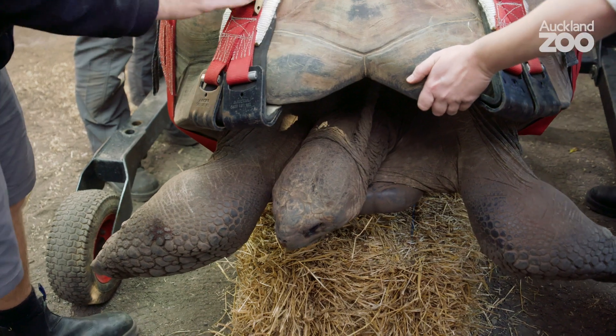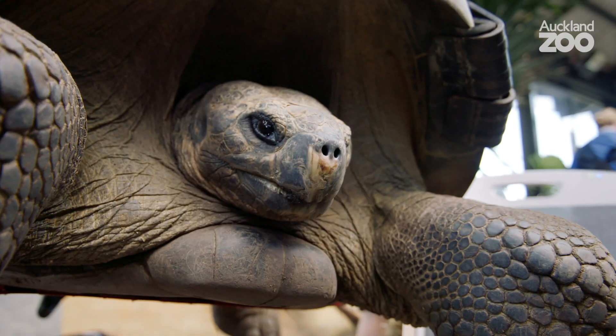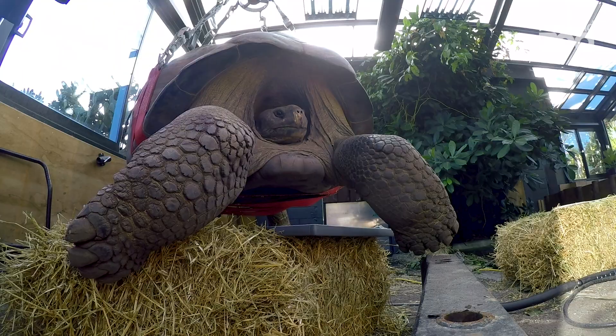One of the challenges with looking after these tortoises is that they do everything really slowly — they eat slowly, they move around slowly, and they also heal really slowly. Today was about getting pictures of those bones again to make sure everything's still looking good, reassuring ourselves that a muscle strain or injury is still the most likely problem. This is about giving him the time he needs to heal and looking after him in the best way we can while he heals.